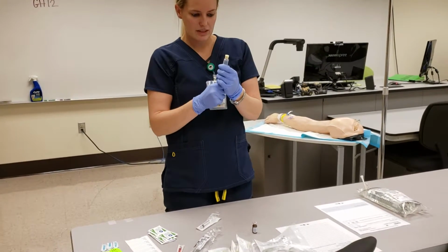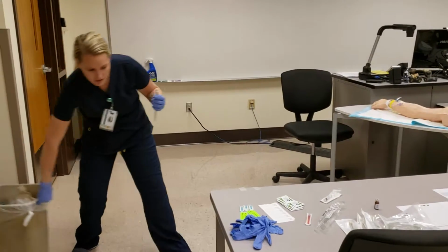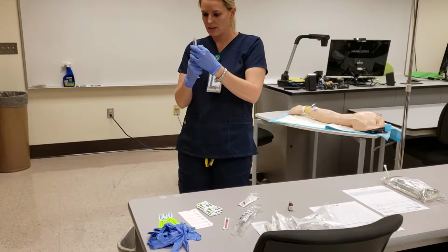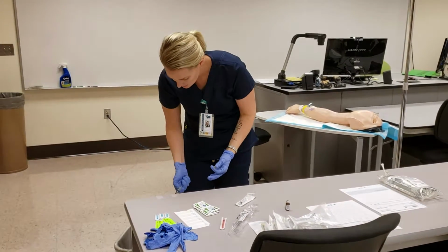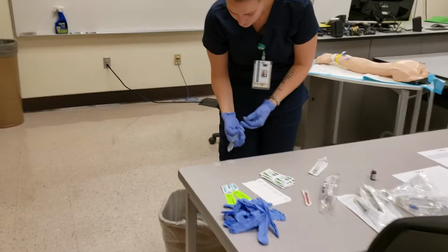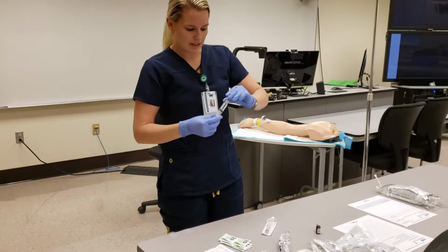Start with this. Okay. So I'm going to waste part of this. So I've wasted part of that, replace this.